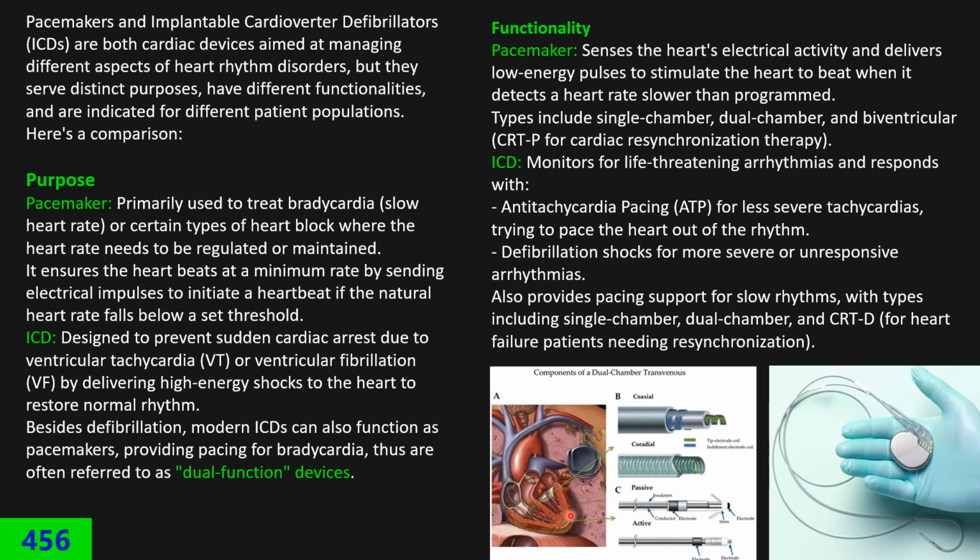We have to keep in mind that anchoring usually doesn't penetrate because of the structure and shape of the tip, but the active type is embedded and the risk of perforation is higher. Besides that, we have another type of ICD that is leadless or wireless, which I'm going to show in the next slide.